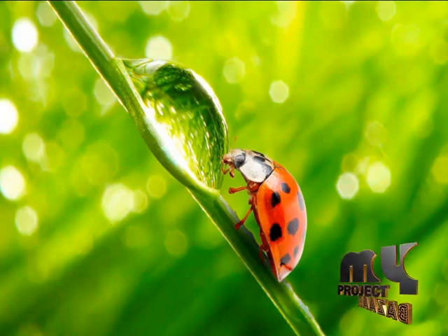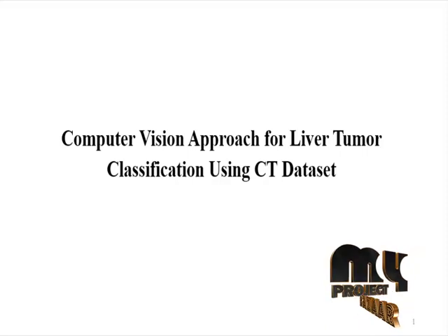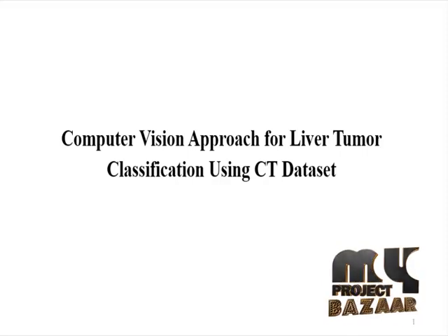Welcome to myprojectbazaar.com. The title of the project is Computer Vision Approach for Liver Tumor Classification using CT Dataset.